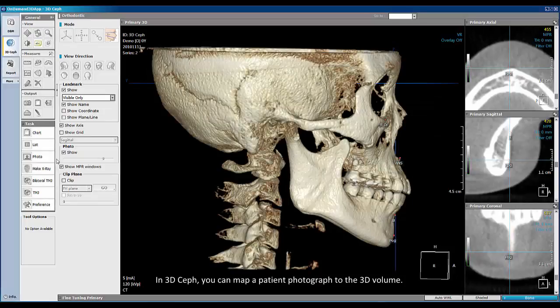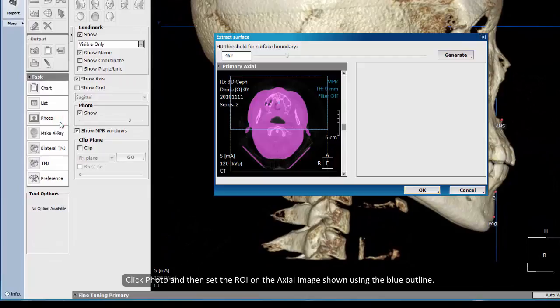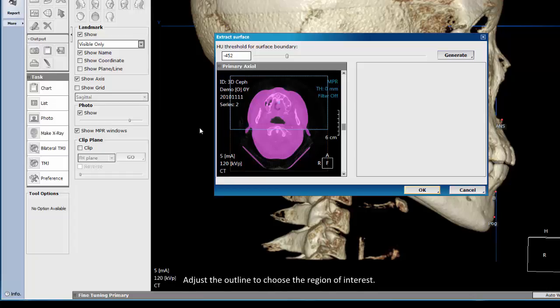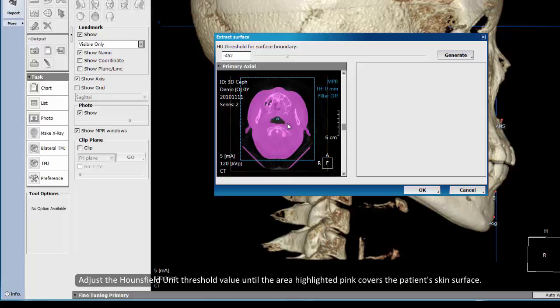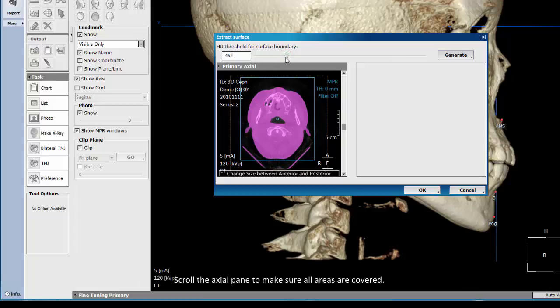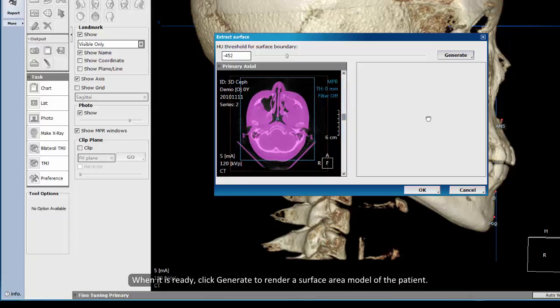In 3D Ceph, you can map a patient photograph to the 3D volume. Click Photo, and then set the ROI on the axial image shown using the blue outline. Adjust the outline to choose the region of interest. Adjust the Hounsfield Unit threshold value until the area highlighted pink covers the patient's skin surface. Scroll the axial pane to make sure all areas are covered.